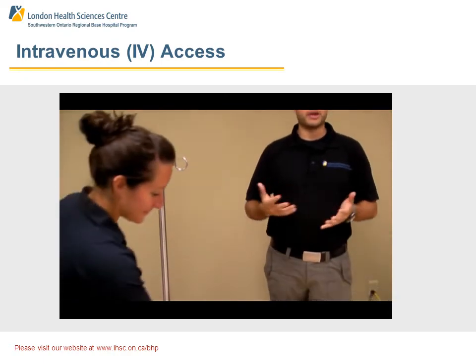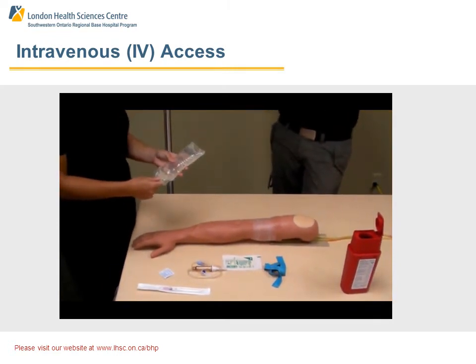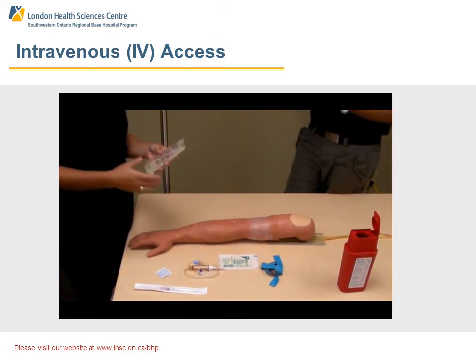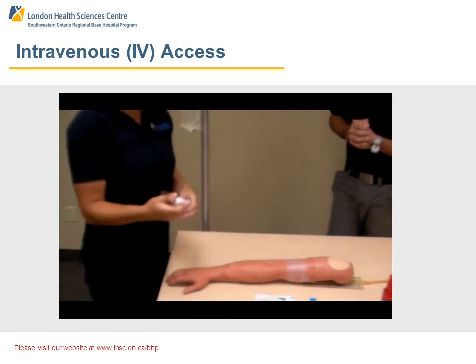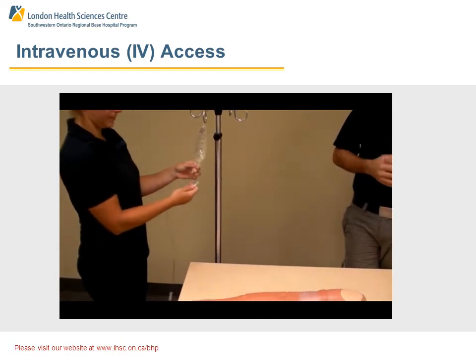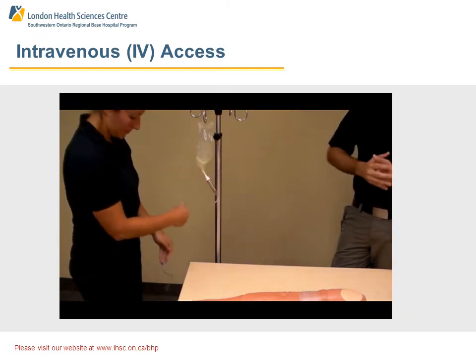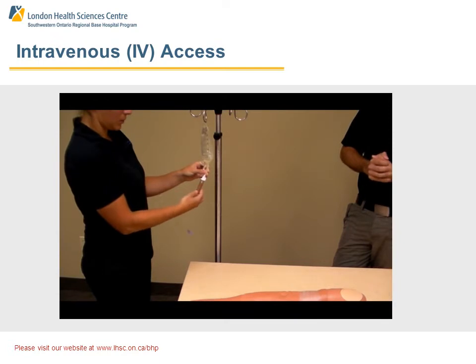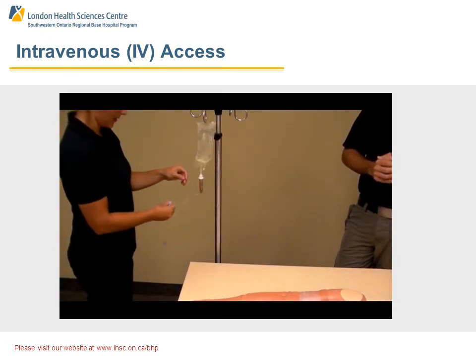Like the skills we teach here at SWORB, preparation is the key. You want to make sure you have all your equipment out and ready at the beginning of your procedure. First step, I'm going to have a look at my solution. I have normal saline, a 250 mil bag, and I want to make sure that the expiration date is good, that there's no condensation on the inside of the bag, and no particulate matter inside the bag. I'm also going to grab my appropriate drip set and prime the bag. Priming your IV tubing means filling the air currently inside the tubing with saline solution, so you don't introduce air into the vein. You're going to squeeze the drip chamber so that it fills about halfway with the normal saline, and open up the line to make sure that there's no air in the line at all.